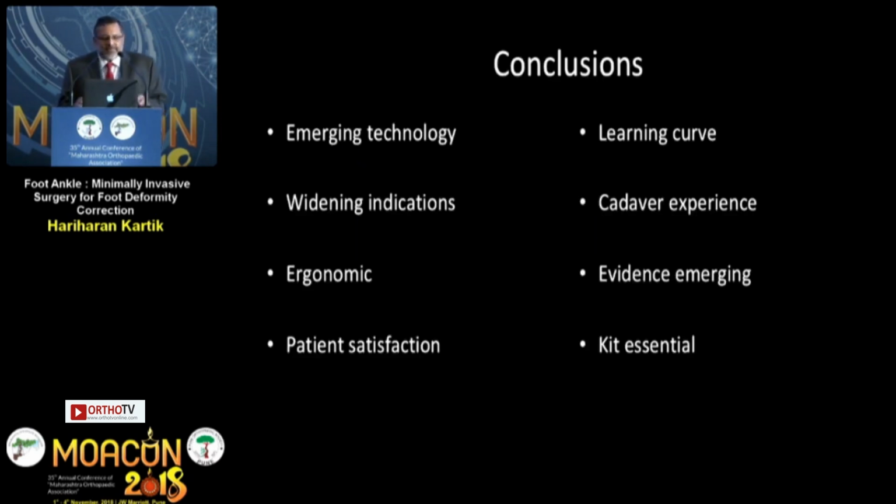So in conclusion, it's an emerging technology and the uses are increasing exponentially. We now have the pediatric surgeons who look upon it like gulab jamun, where they think, my goodness, if I can do all of my osteotomies. So all of the intertrochanteric and femoral osteotomies now in a few centers in the UK are being done by the minimally invasive procedure. The indications are rapidly expanding. It is very ergonomically friendly because you get excellent feedback from the burr, and the patient satisfaction scores that we've collected so far have been very, very encouraging.